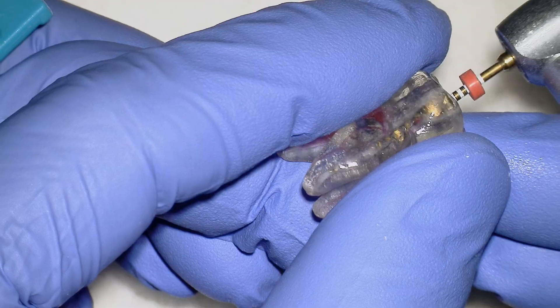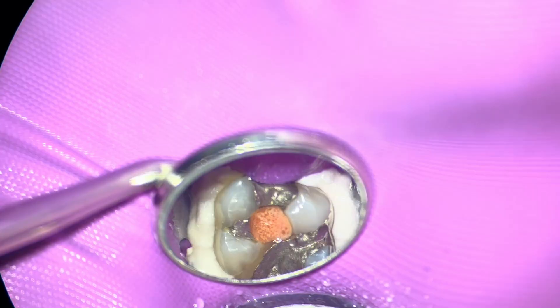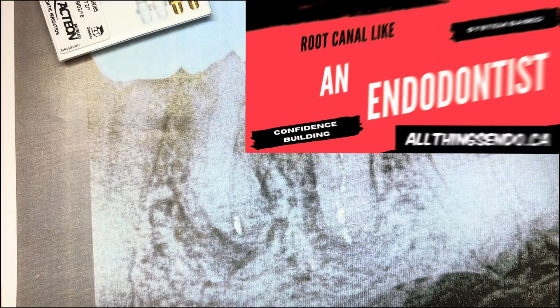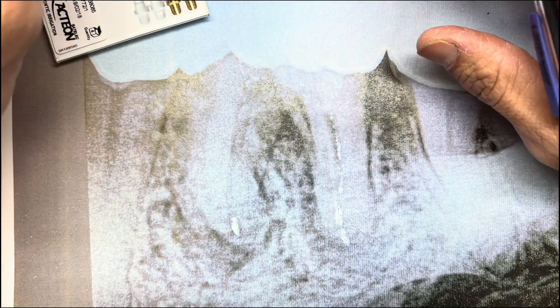I'm sure you've been here if you've done enough endo. You're doing your access — you've already cleaned and shaped — you're refining your access or just going back in, and sure enough debris falls to the apical portion of your mandibular root. This case was sent to me and asked: how do I get this debris out of here? Well, I can tell you: with absolute difficulty.